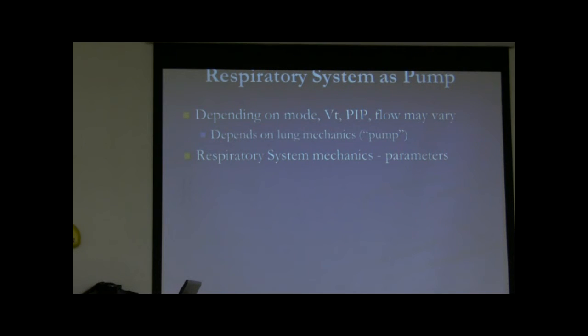And in terms of the pump function, you have to take into consideration what we call lung mechanics. Okay, so how is the pump functioning? There are two major things we look at in terms of how the pump is functioning, and we use that to adjust how the ventilator is now going to give the breath. So one of them is called the resistance of the airway, and the other one is the compliance of the respiratory system. And we calculate it in these ways, where we use certain parameters.